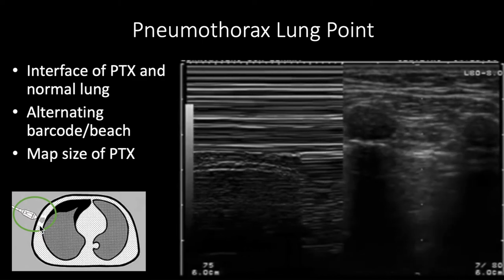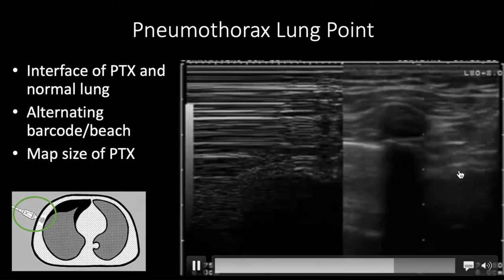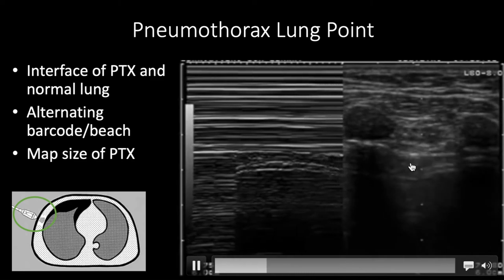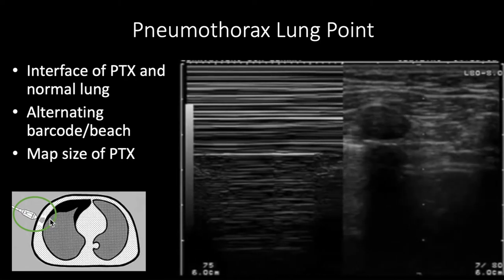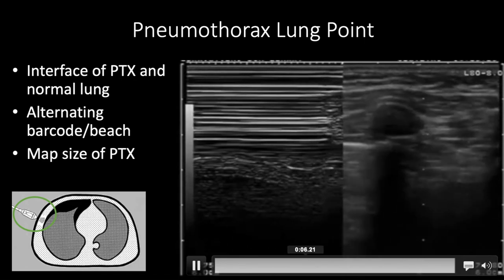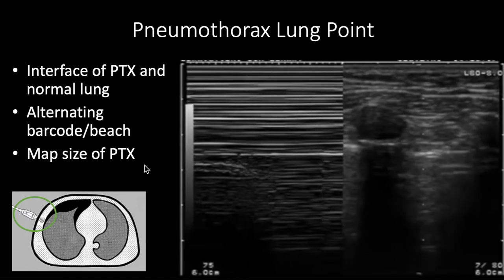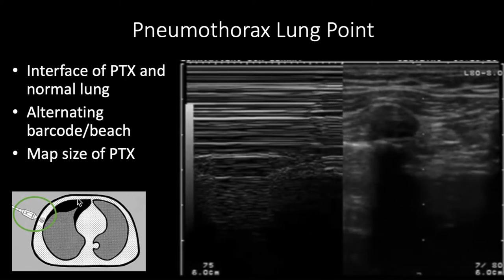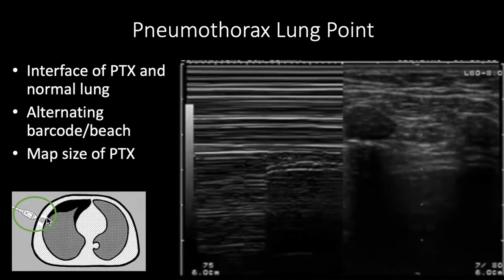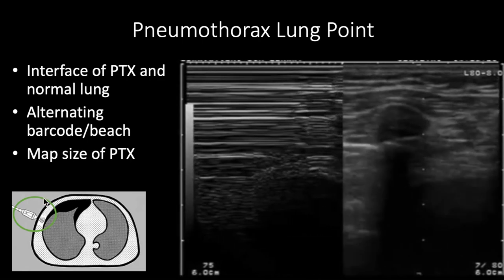If you slide your probe down, you may see the interface of the pneumothorax and the lung as it comes up away from the chest wall — we call this a lung point. Here's the tip of the lung, and as it recedes, the pneumothorax appears: lung, pneumothorax, lung, pneumothorax. As the patient breathes, you can see the lung come to the chest wall and recede. With M-mode through the same area, you'll see alternation between granular beach and barcode. The lung point can also let you map the size of the pneumothorax — a small PTX will have the lung point anteriorly, while if there's no lung point anywhere across the chest, you may have a very large pneumothorax.